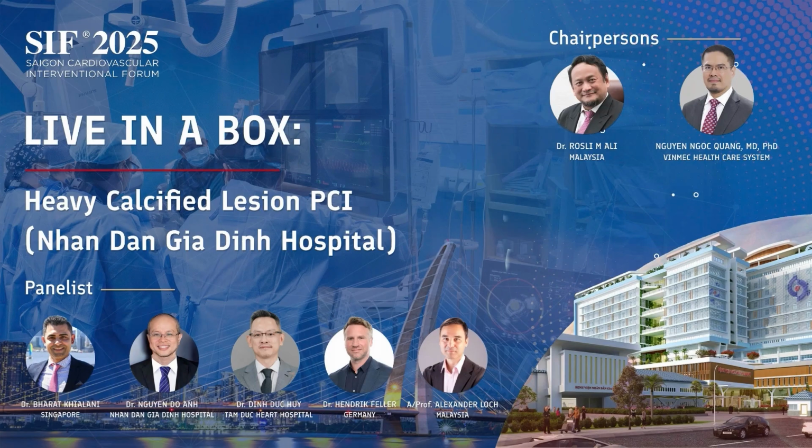I think the heavy calcium throws a bit of a shadow, actually. So in practical terms, normally I rely on the balloon expansion in calcified lesions. If the IVL can expand well, I'm usually happy, and I don't even look with IVUS for cracks in the calcium. Sometimes we just go ahead and stent and assume the vessel is sufficiently prepared. Here there are no cracks at all, and we know the 3.0 is relatively too small for the ostial left main, so it needs more preparation. To save cost, I agree, I probably would go with a normal balloon first, a normal cutting or scoring balloon first, 3.5, 4.0 or whatever, and see whether that does the trick.